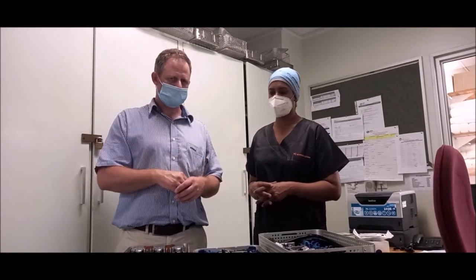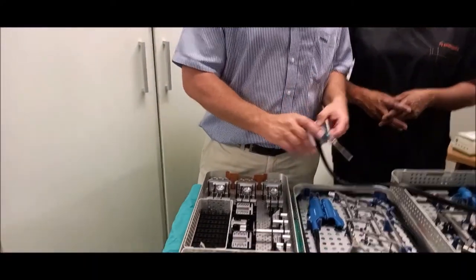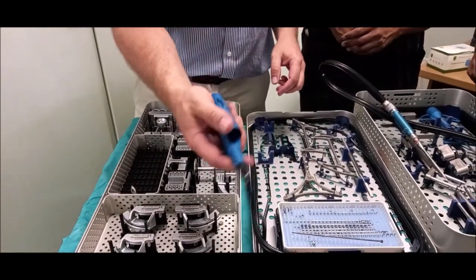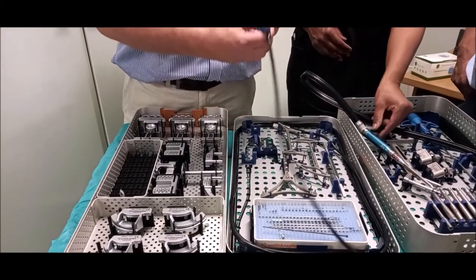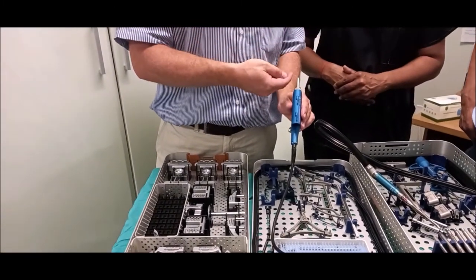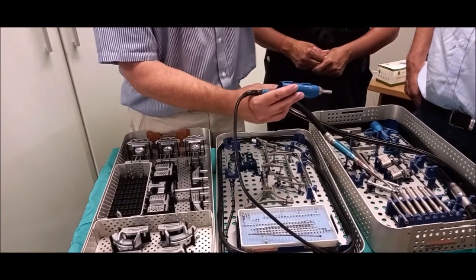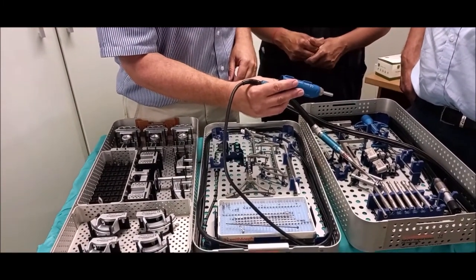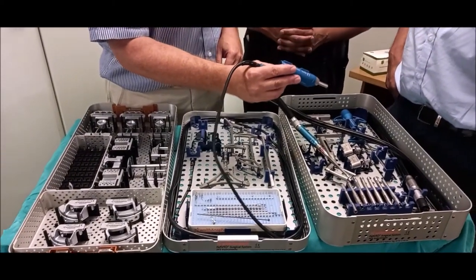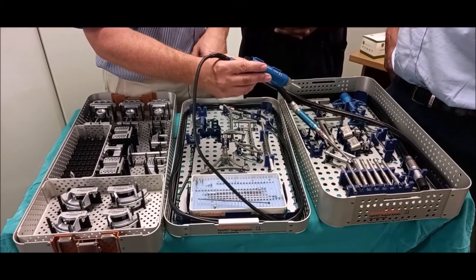Essentially how it works — we'll show you the robot now. It starts with the burr, with a little handpiece. The burr sits into this hole here and shoots in and out to make cuts. It's a handheld robotic device using sensors connected close to the knee. As we move this burr across the surface of the femur and the tibia, it shoots in and out and makes accurate cuts of the bone.